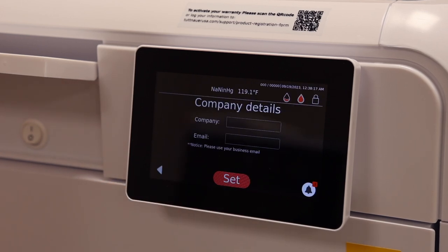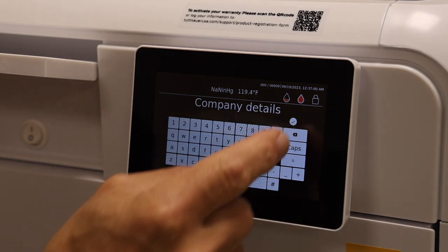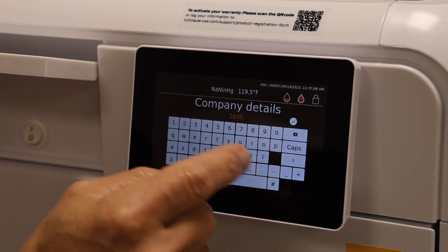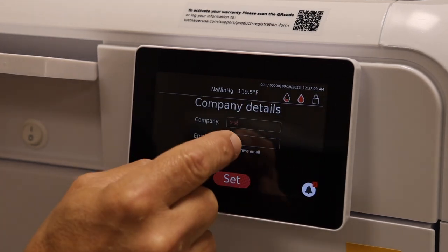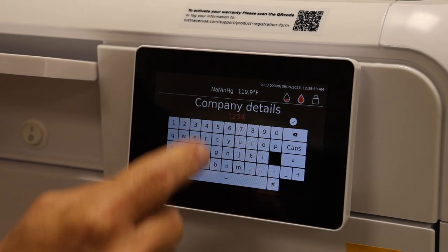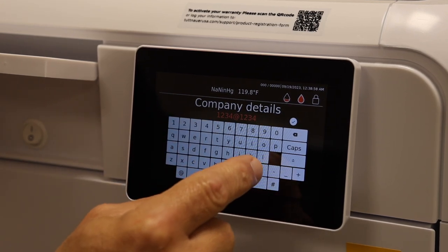Hit Set, and then under Company Details you can enter either the company you purchased your sterilizer from or your practice name. Tap the screen to type the name — we'll call this 'Test' — hit the checkmark, and then enter an email address.